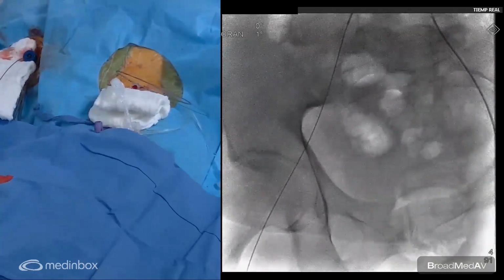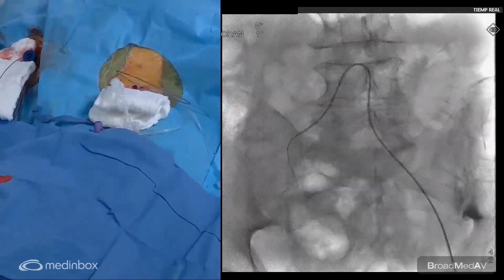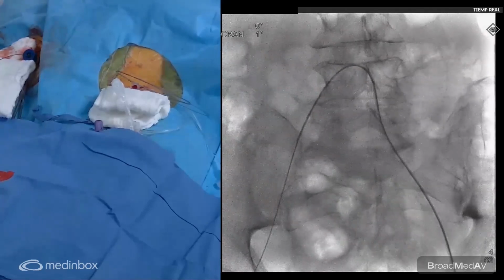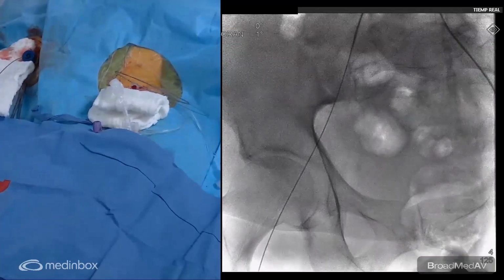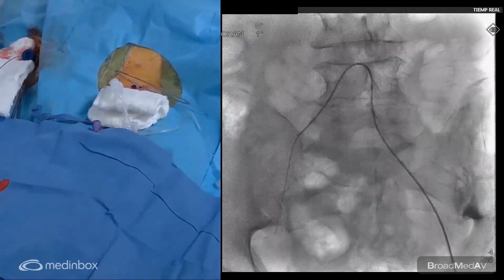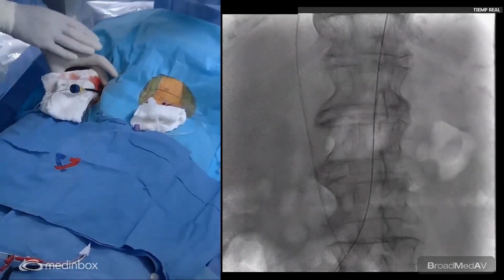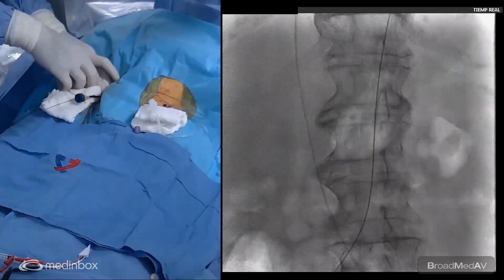Any special characteristic that you want to point out, Fernando? Yeah, this is an expandable sheath. So it is 14 as it comes. And then before advancing with the valve, we will open with the 18 French dilator. We will introduce this catheter. We exchange for extra stiff Amplatz wire.